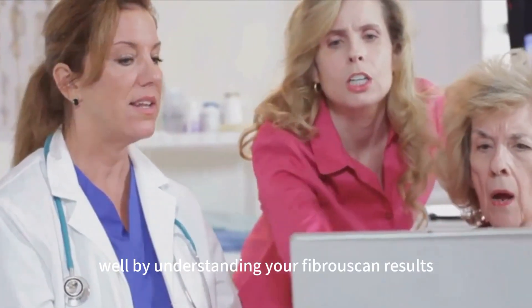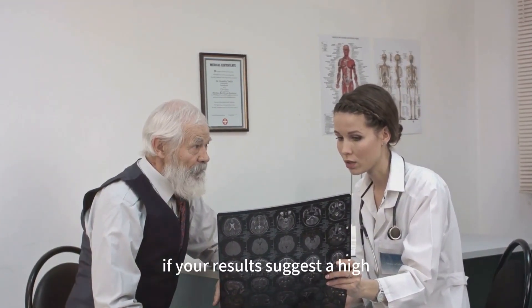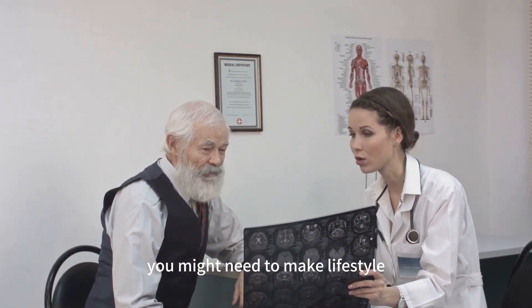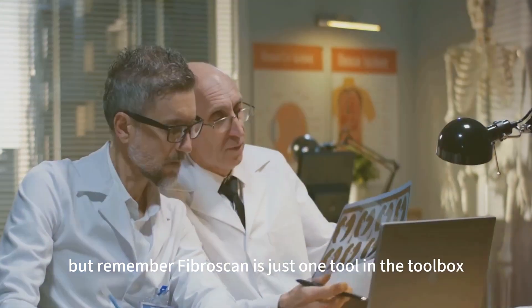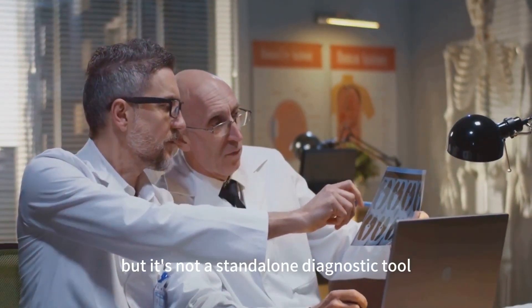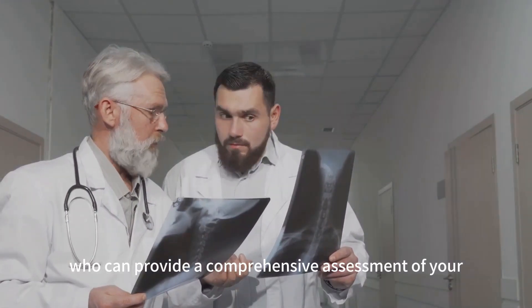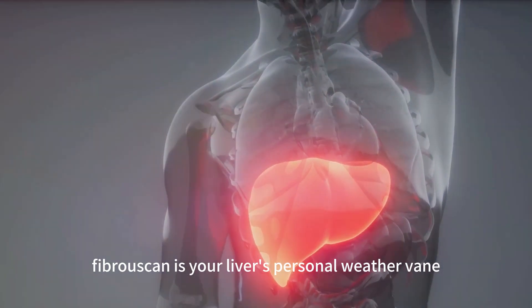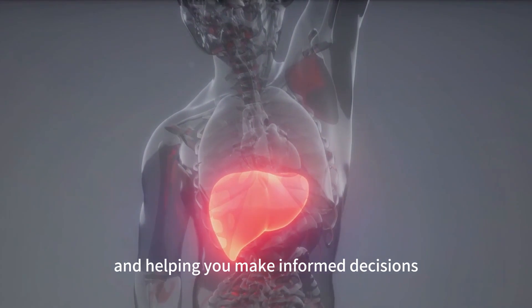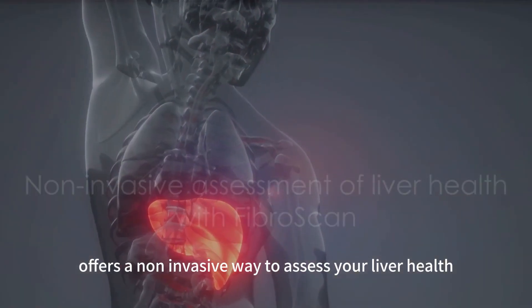So, why is all this important? By understanding your FibroScan results, you can take proactive steps to maintain or improve your liver health. For instance, if your results suggest a high degree of fibrosis or steatosis, you might need to make lifestyle changes or seek medical treatment. But remember, FibroScan is just one tool in the toolbox — it's not a standalone diagnostic tool. It's always best to discuss your results with your healthcare provider, who can provide a comprehensive assessment of your liver health.